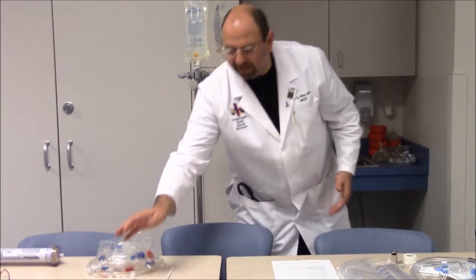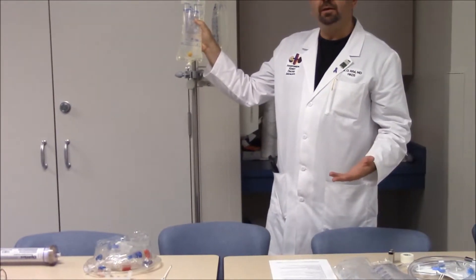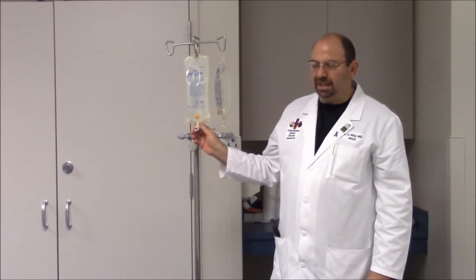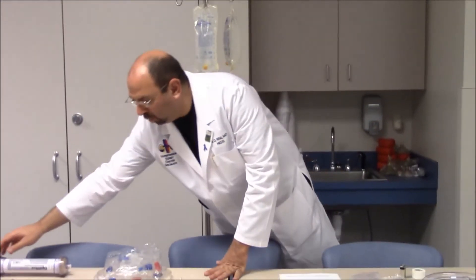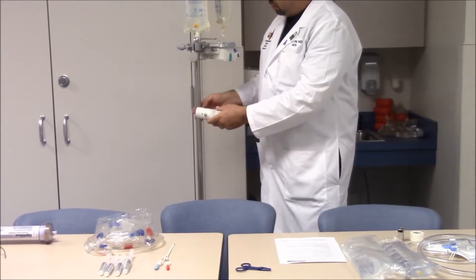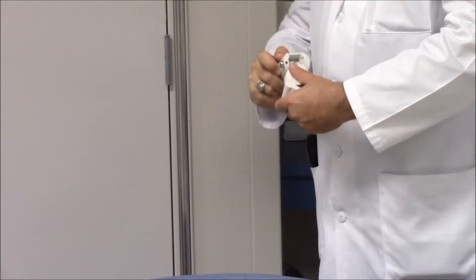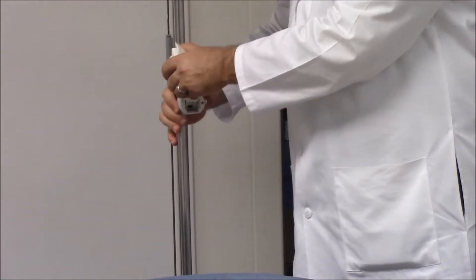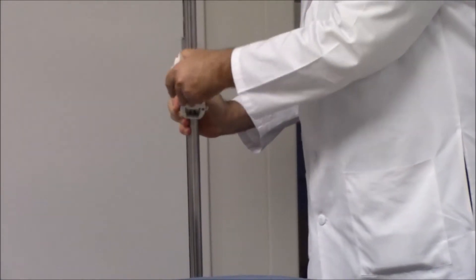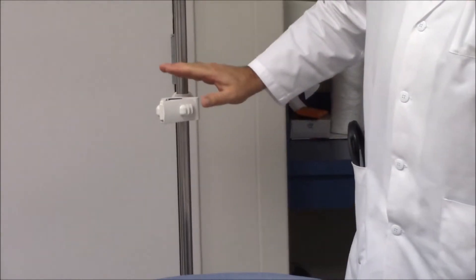Another item needed is the IV pole, which is used initially for hanging the priming fluid and then continues to be used as the process goes on. We also need a hemodialysis filter holder — a holder that attaches to the pole so we can hold the hemodialysis filter through it.